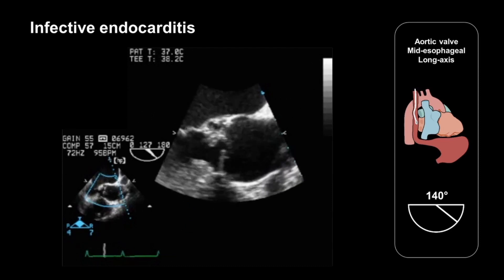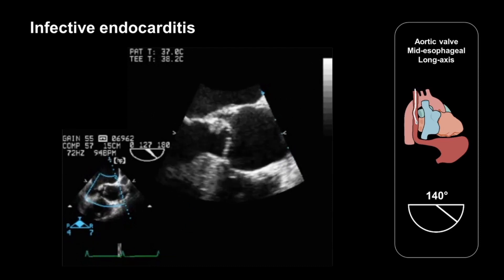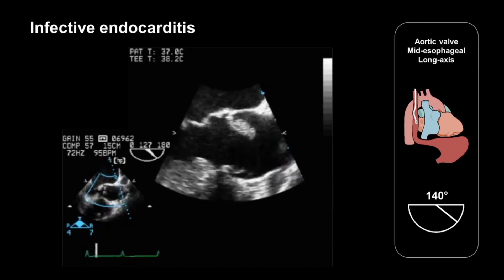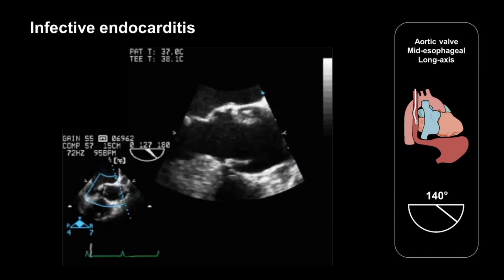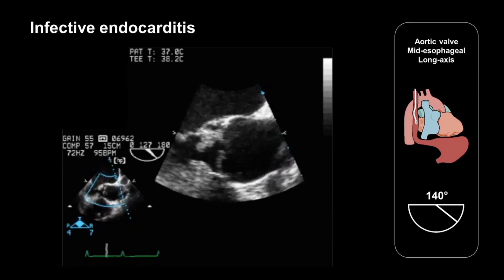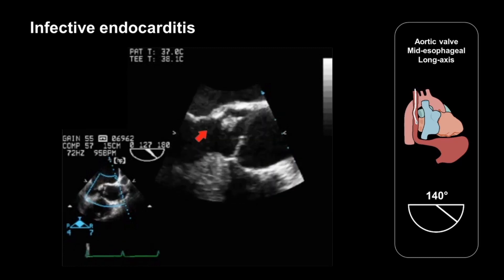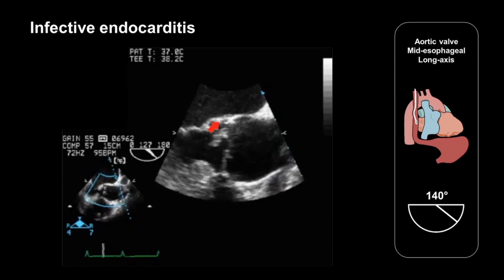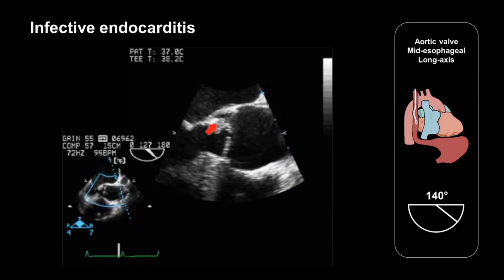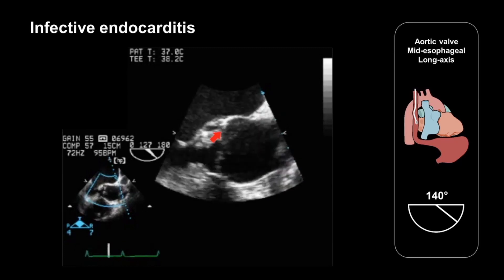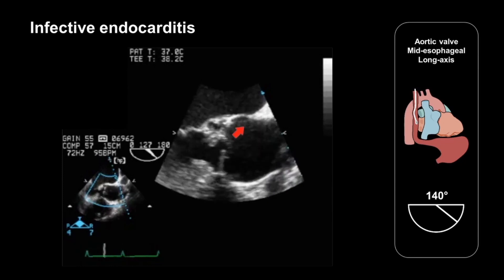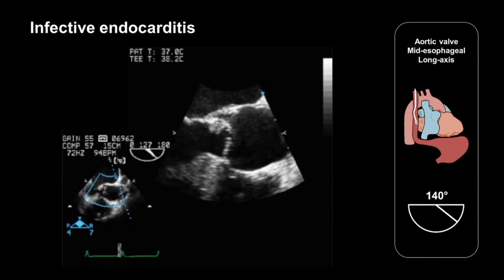Here we have a patient with infective endocarditis. They have an irregular mobile oscillating vegetation on the ventricular aspect of the non-coronary cusp.